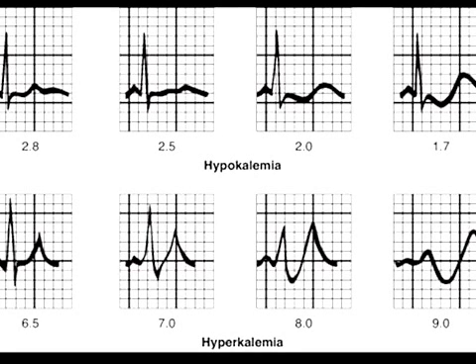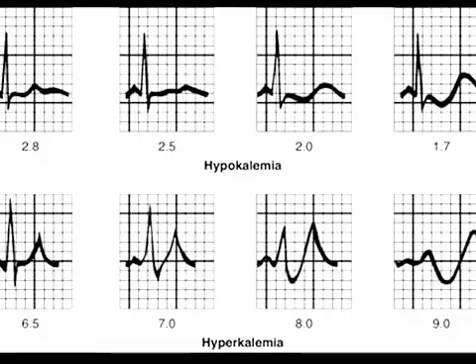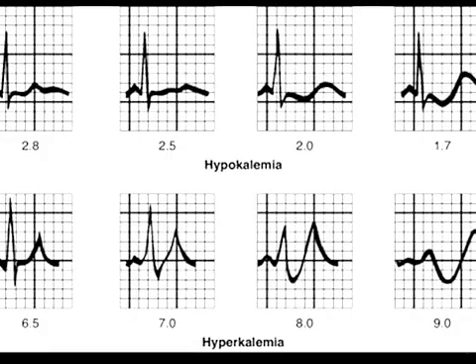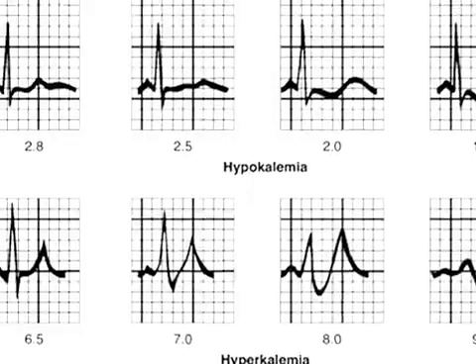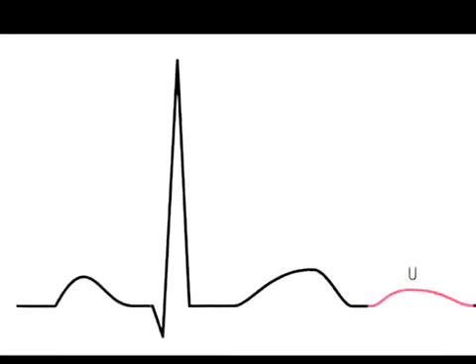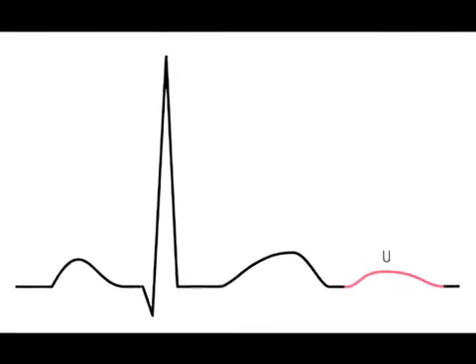Let me show you a clearer U wave. Just look at this EKG — you can see the U wave here; it comes after the T wave. This is characteristic of hypokalemia, that is low potassium level less than 3.5 milliequivalents per liter.